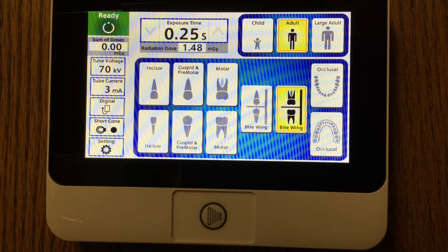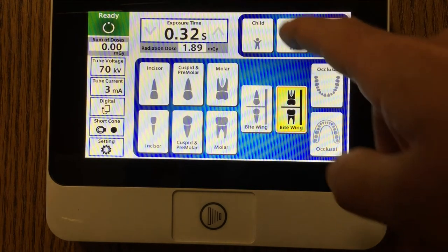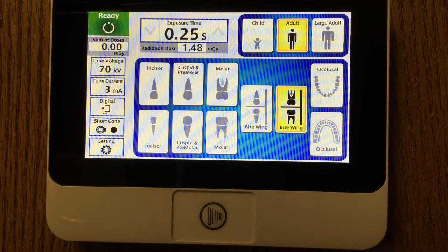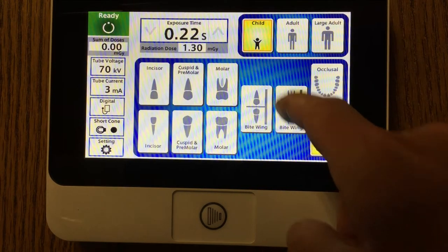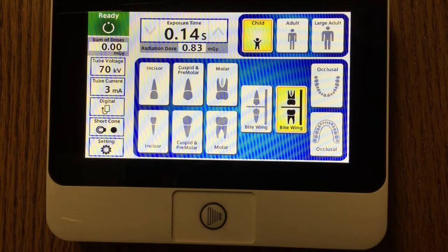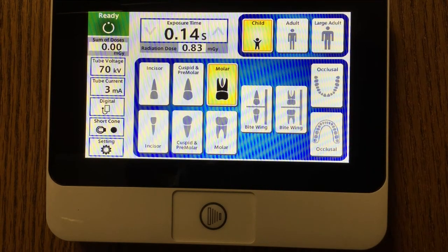This is the home screen for the Belmont FOTEX LCD intraoral x-ray. As you can see, the operator will be able to select from a variety of patient sizes — from large adult, standard adult, or pediatric/child x-ray. The operator will also be able to select if they want to take an occlusal image, a posterior bite wing, an anterior bite wing, or a PA in different locations of the mouth.